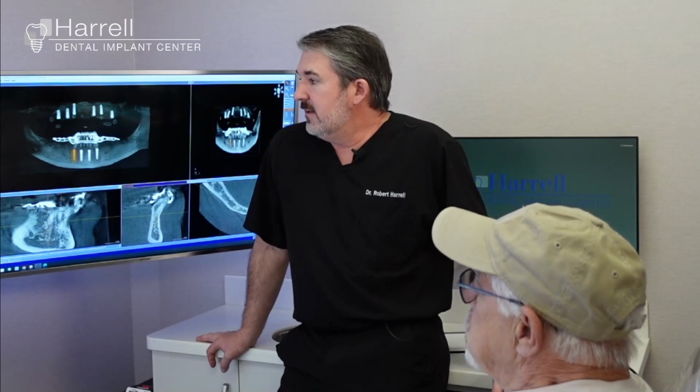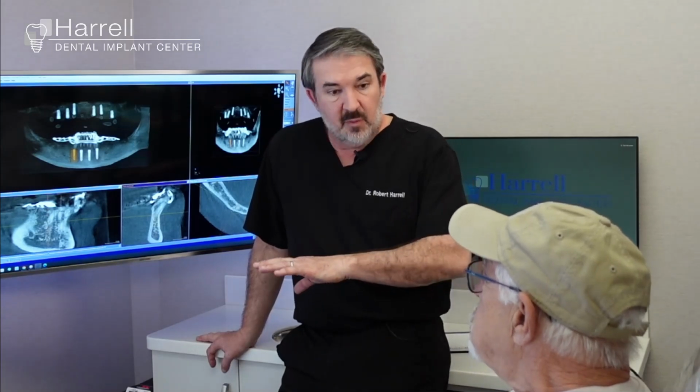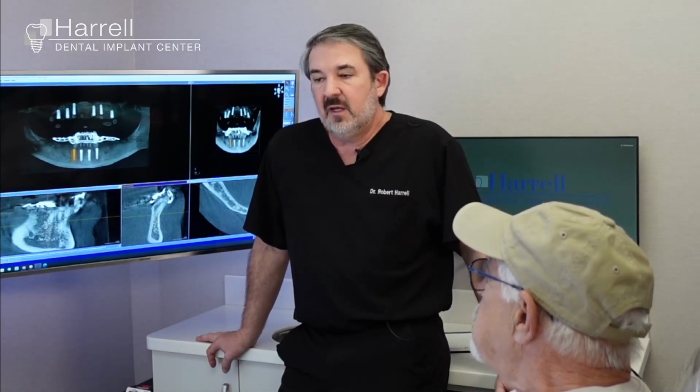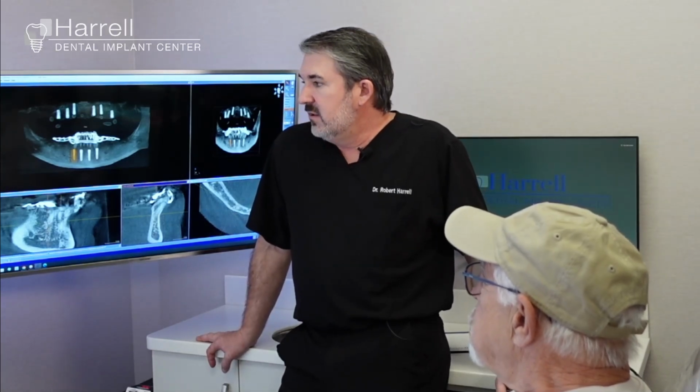So the day of surgery, you'll come in, we'll put you to sleep. The anesthesiologist, Dr. Atwood, you've met with him or talked with him, will be here to put you to sleep. We'll get started on the procedure. We'll get all the teeth out of the way. It looks like you only have about 6 natural teeth remaining. We'll install our surgical guides, do everything we need to get the implants placed, sew everything up, get the teeth fitted, wake you up, and send you home.